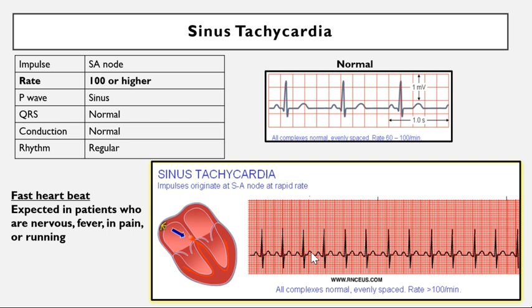Oh. Yeah, I don't know what that is. So whenever I stand up, my heart rate goes up to like 130. Oh, dang. And then it slows down over time? Yeah, and then my blood pressure drops. And you feel it whenever it's happening? Do you feel pain? I've had some fainting episodes before. Oh. Break out in a sweat. Yeah, that's crazy. Well, there you go. That's what your EKG looks like. Not bad. So yeah, everything looks pretty normal.